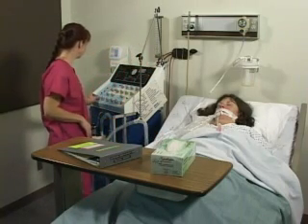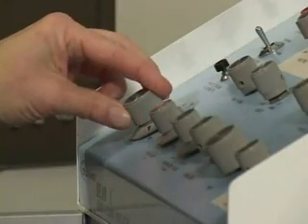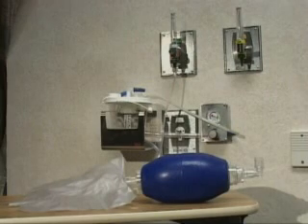The client should receive a brief period of high concentration of oxygen. This is called pre-oxygenation. It can be accomplished with a manual resuscitation bag or with a setting on the ventilator. Using the ventilator setting, pre-oxygenate according to agency policy and patient needs. Modifications in this step are made for clients on PEEP. If using the manual resuscitation bag connected to an oxygen source, squeeze the bag every 5 seconds for 30 seconds to hyperinflate the alveoli and increase their oxygen stores temporarily.